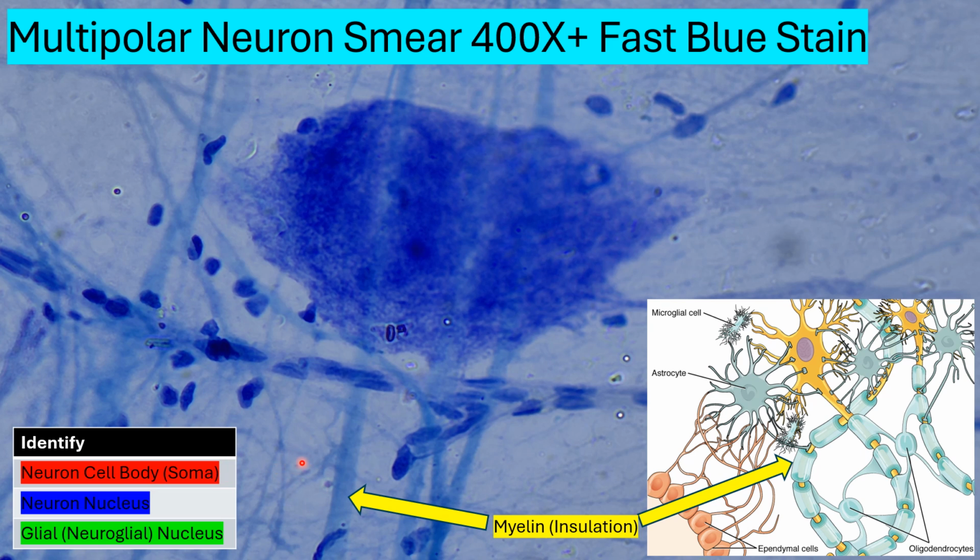So we have myelinated versus non-myelinated, although it's not 100% clear for this sample. Do note that in this sample, there are only about 10 neurons, and this was the best sample that we could find. And neurons are three-dimensional, and we smear across the slide, and it gives us this 2D structure. So we lose a lot of the defining factors. So you just kind of have to look at the overall shapes and what we're identifying over here.